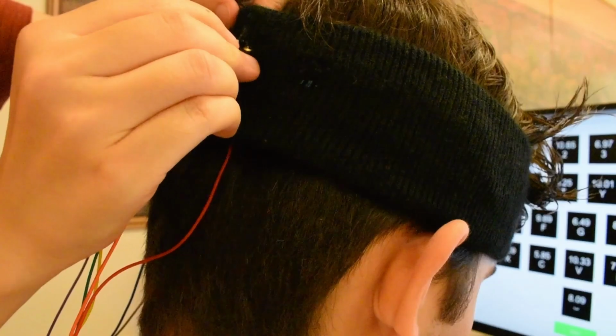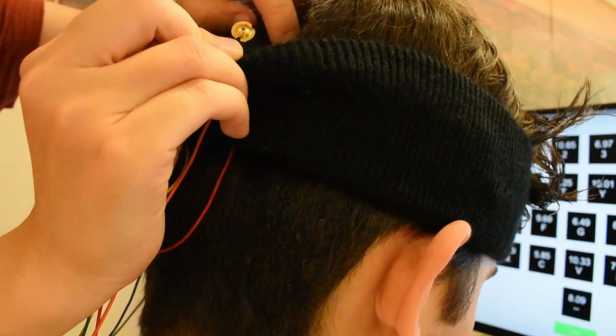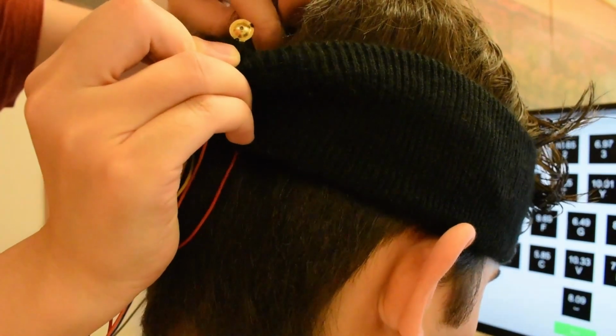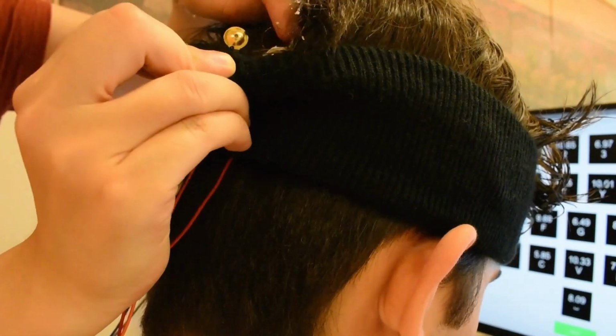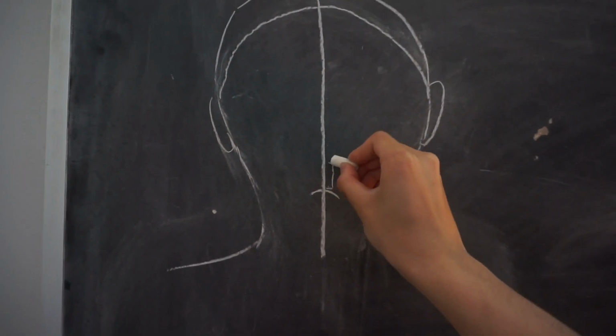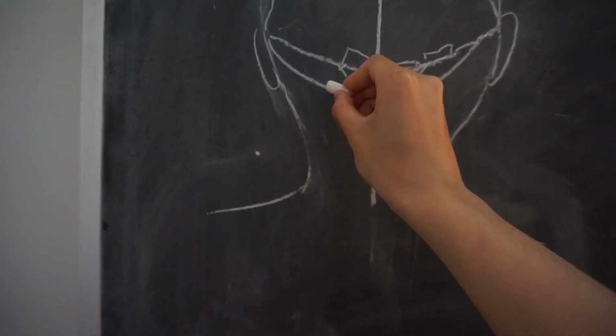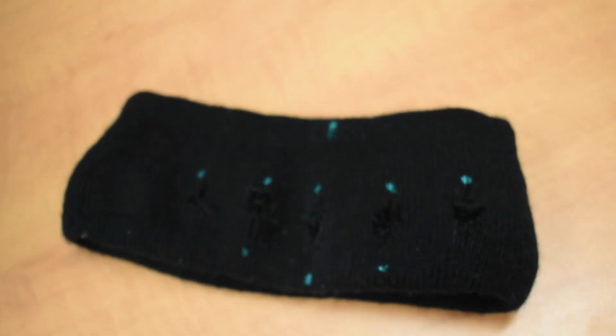Setting up wet electrodes on the occipital lobe naturally presented many challenges. The participants' hair in particular would cause the electrodes to move and fall off occasionally, causing long setup times and variable electrode placement. We decided to fix the electrodes in place using a headband that used the inion, nasion, and helices of the pinnae as landmarks, and this helped to reduce setup time and increase setup consistency across participants.